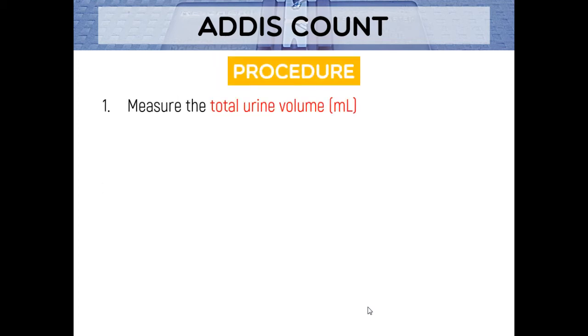Number one is, of course, since this is a 12-hour or 24-hour urine specimen, timed urine specimen, we always have to measure the total urine volume, of course. Muna pulo sa graduated cylinder. Okay, so ato na i-measure dito. And then really sadya yun yung mga inani guys. Samot na, you'll have a 24-hour urine specimen na po din clean chem ninyo na lab sa creatinine clearance.